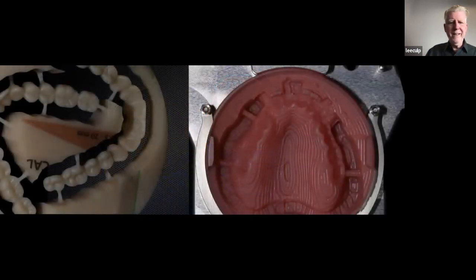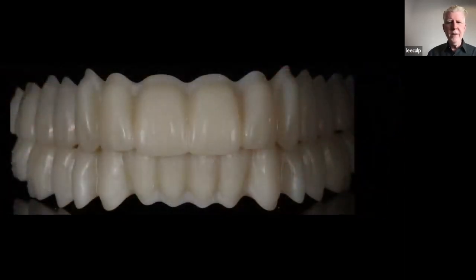So there's our teeth. There's our disc. We mill full now all the way. And there's our set of milled teeth. So it doesn't really matter whether it's milled or printed. This is what they come out looking like. Now, for the average denture, this is actually pretty good. You can take it out of the mill, don't touch it, bond it into the base, go to your pumice and polish it up and put it in the mouth, and everybody's good.